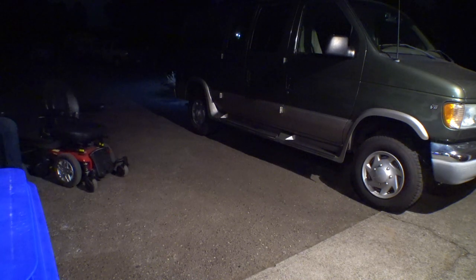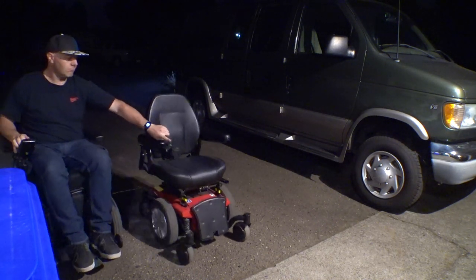It just keeps going straight until you pull backwards. Today we're going to look at another somewhat uncommon feature that most power wheelchairs have. After using an Invacare chair with the ASL head array setup and its cruise control mode, I realized latch driving is actually kind of interesting. Pretty much all Permobil chairs and really any wheelchair has latch driving or cruise control baked into it. So today we're going to try out a few different chairs and see how the cruise control works on them.